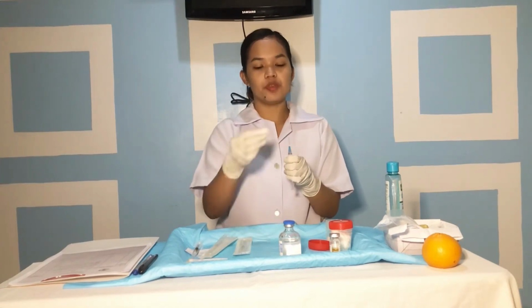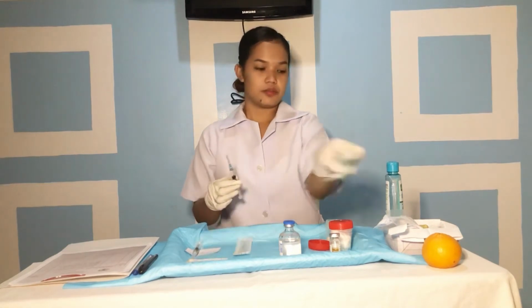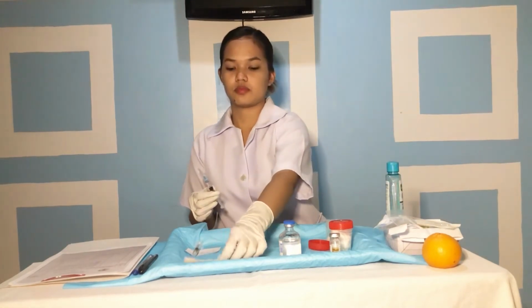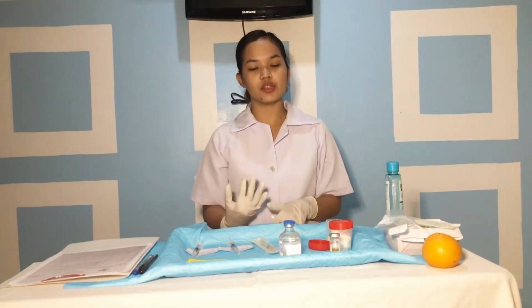We scoop the needle to recap. Compare the label of the medication with the medicine ticket for the final time at the patient's bedside before administering the medication. This is the third accuracy check. Then we return the unused multi-dose medication vial to the shelf, drawer, or refrigerator. Proper disposal of glass and needle prevents accidental injury to staff and controls transmission of infection. That's all for the vial and ampule preparation.